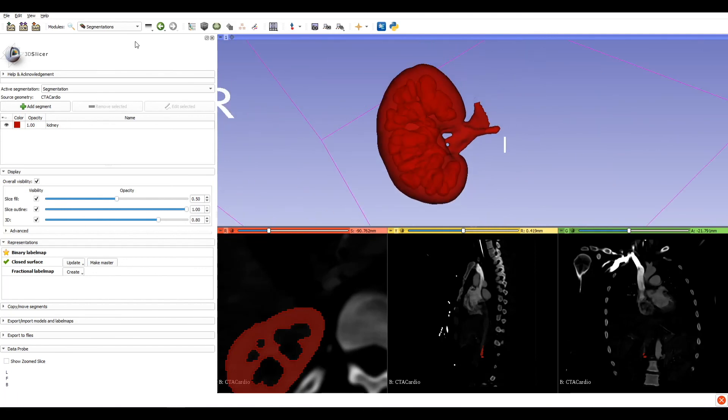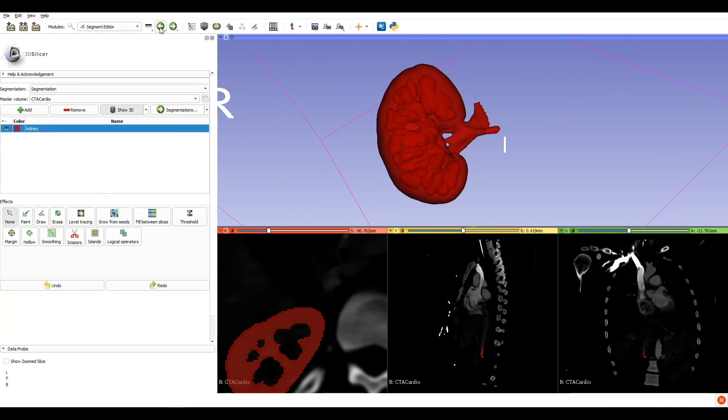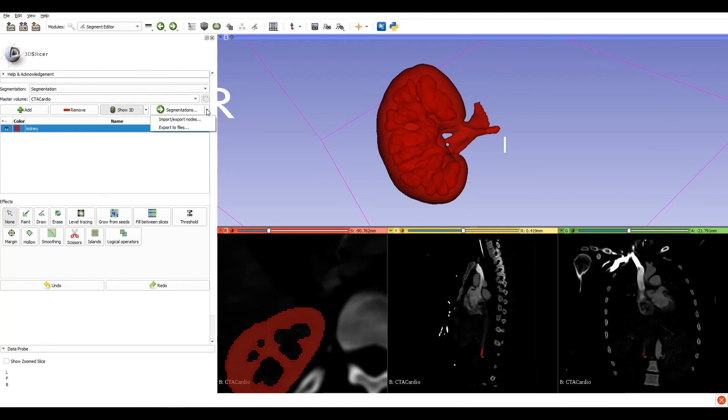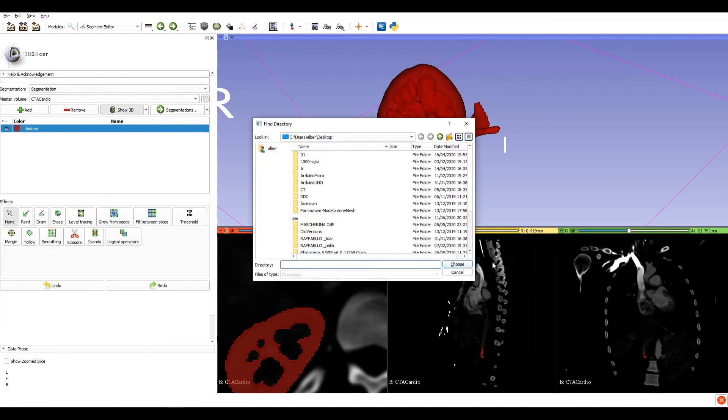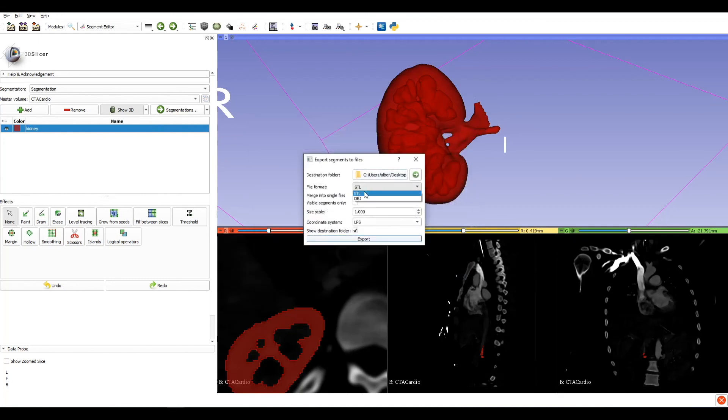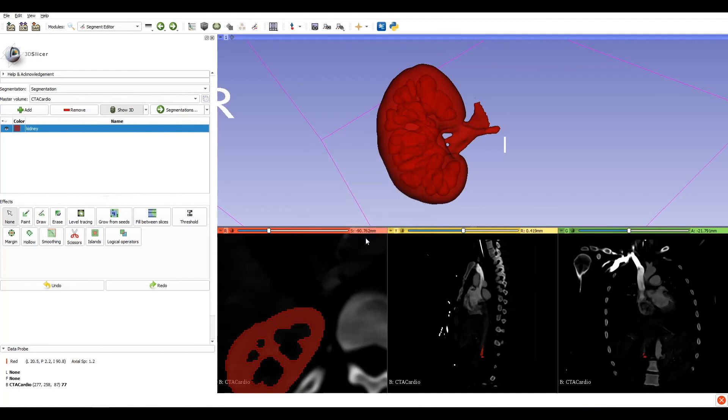Now the shape of the kidney is good. We can check if inside there is something strange. We can go on segmentation here in 3D, move the handle of the opacity, and we see that it's a very good kidney. Now we need to export. Go back to segmentation editor. Here, on the left of segmentation button, there is an arrow. Click on it and export file. Now we can choose the destination folder, choose the format and the scale. Click on export and it's done.